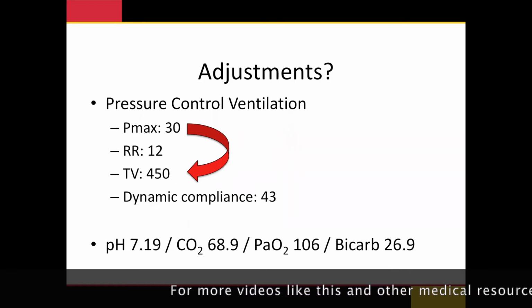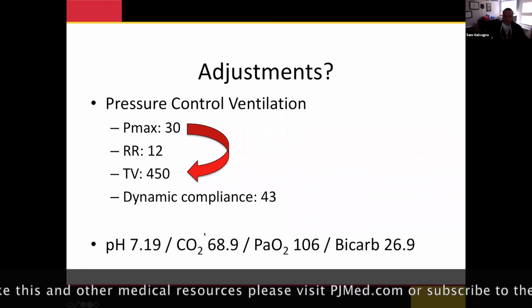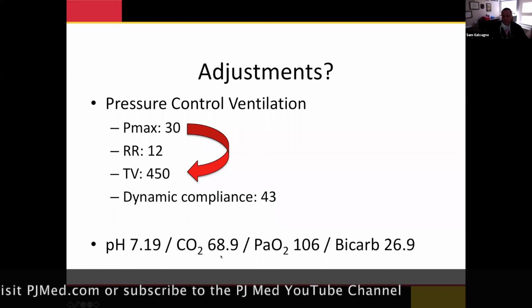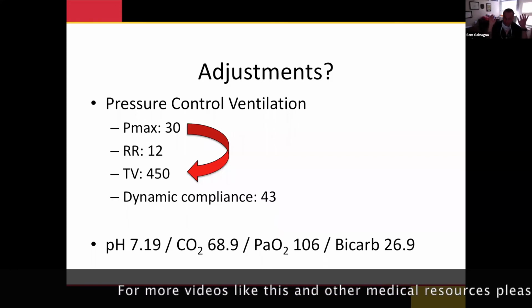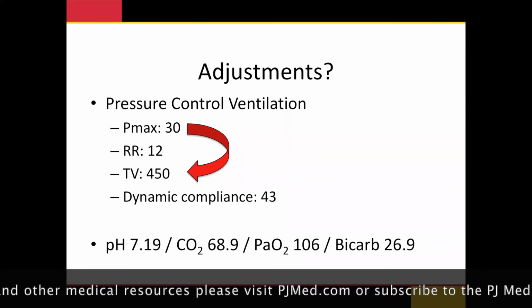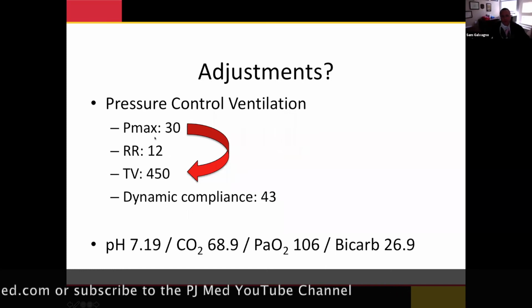Acidic, exactly. Anything else that you see with this that bothers you? You're hypercapnic. Oh, bonus question. Excellent. So the CO2 is really high. Okay, 68.9. Why? Super bonus question. Why do you think the CO2 might be high in this case? Is there anything looking at those vent settings that you would immediately want to hone in on? Increased respiratory rate. I heard respiratory rate. Yes. So, okay, that's a pretty low respiratory rate.